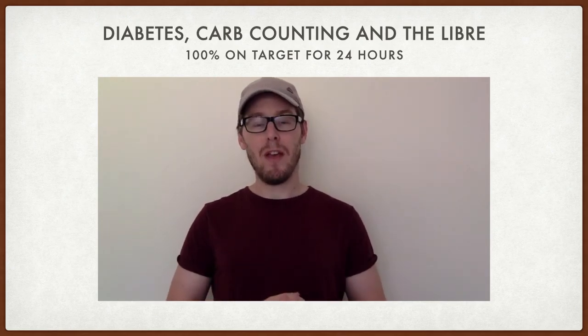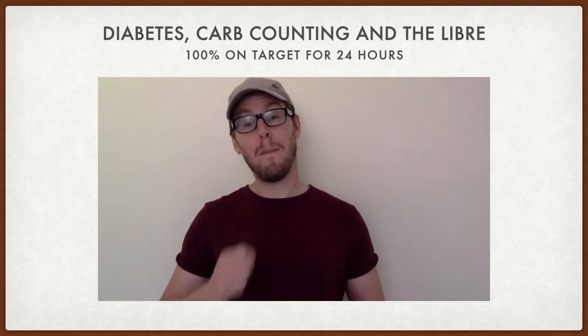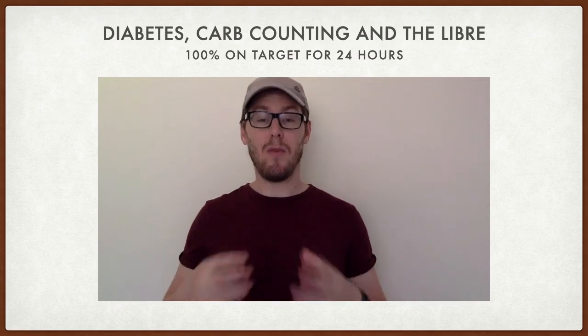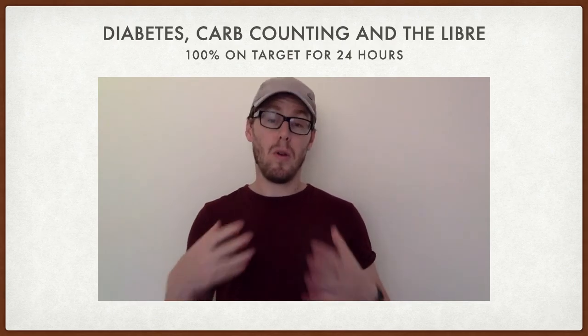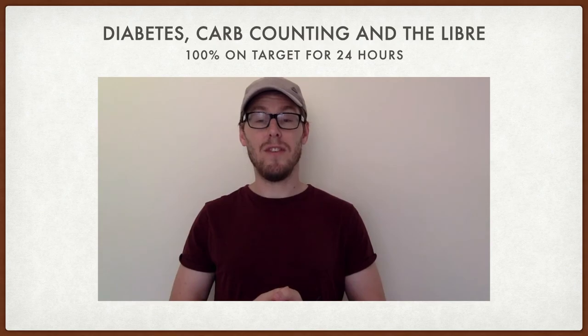My name's Barry, I've been diabetic for 19 years, been carb counting for most of that, but I've only just started to use the Libre. I would say it's life changing, and with that I have a goal of getting my blood glucose 100% on target for 24 hours. I would like to share with you how I go about doing that and let you know if I manage to achieve it.